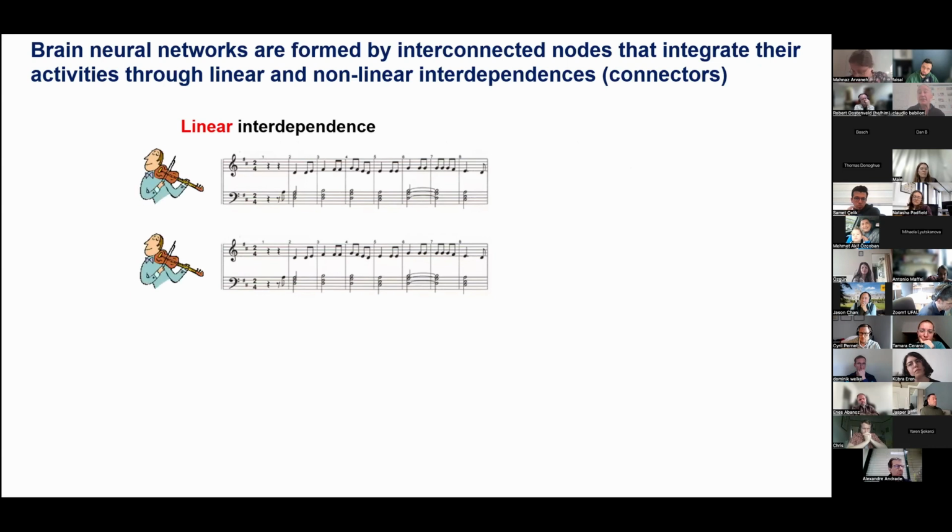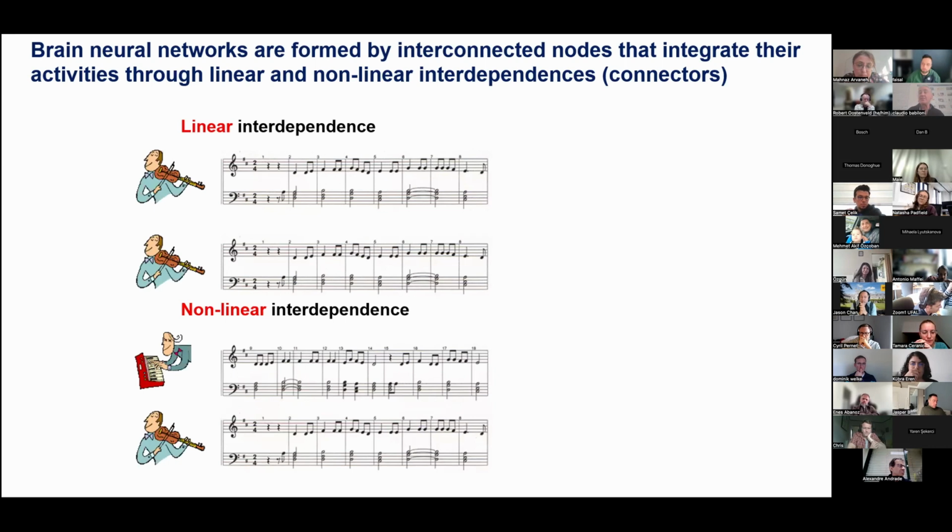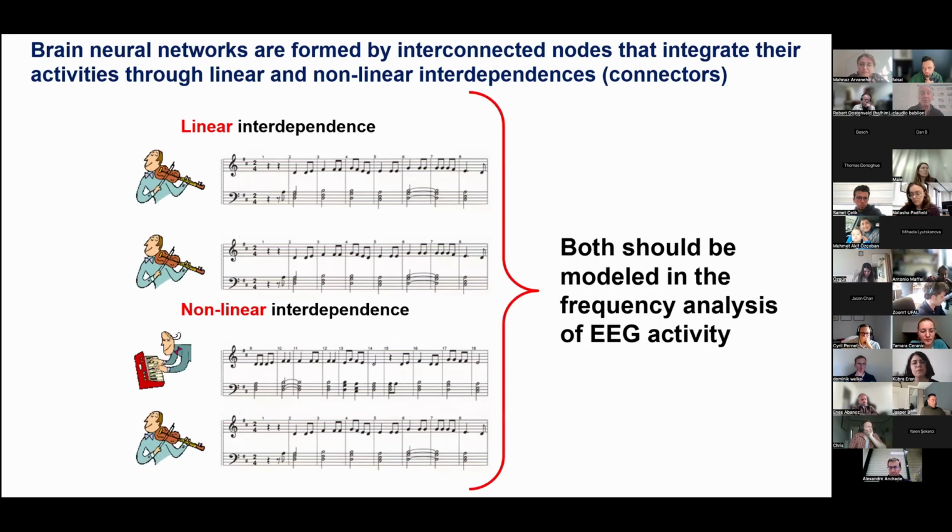Also, the functional connectivity from EEG data shows different options. For example, we have different procedures for investigating the linear interdependence of EEG at the sensor and source level: the spectral coherence or phase lag index, synchronization likelihood, and others. And we have ever more possibilities to analyze this interdependence of EEG data at the pairs of electrodes or sensors with nonlinear techniques, but we do not really know what are the optimal approaches for this point. We know that both are important, but we have several options for linear and nonlinear techniques.